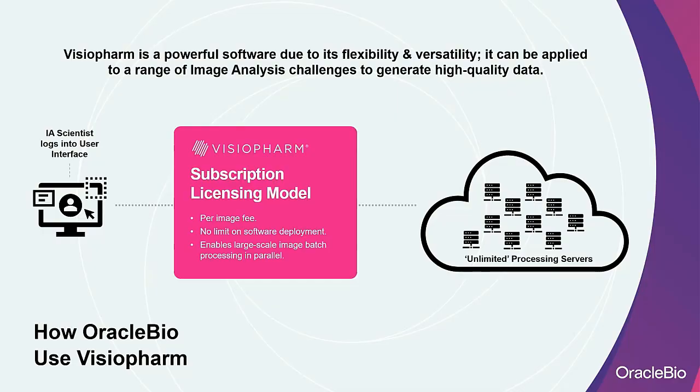So in theory, we can have a single user training an algorithm on one instance, running analysis on a second, and using a third instance to create training annotations. This enhances the rate at which we can complete Visiopharm-based projects, as we are not limited by individual licenses, and we can massively scale the work we do in terms of image QC and algorithm development to fit the unique needs of client projects.